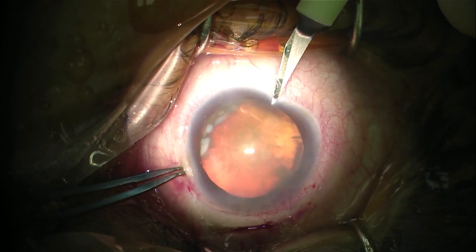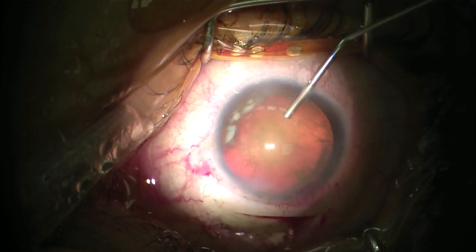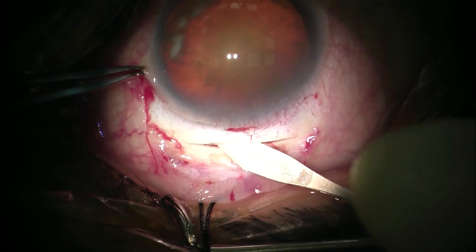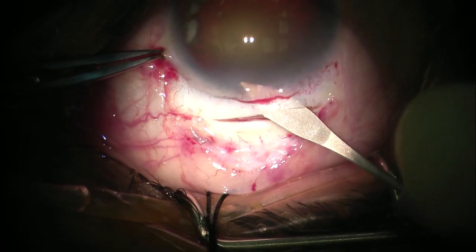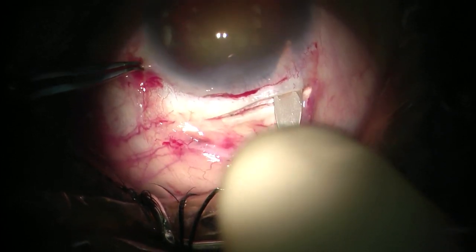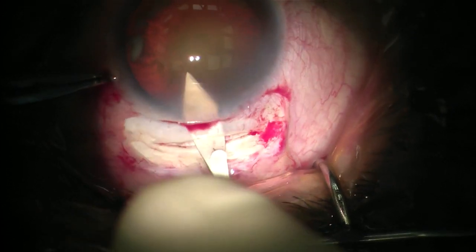Before entering the anterior chamber from the tunnel, we need to create a side port. You can place it wherever you want; I prefer it to be slightly inferior to facilitate removal of the sub-incisional cortex. The anterior chamber is filled with viscoelastic, then we open the tunnel into the anterior chamber. Do not enter the tunnel with the tip of the keratome as this will cause premature entry. Instead, enter with the side of the keratome, and once inside the tunnel, turn the keratome and open the tunnel into the anterior chamber. Make sure the tunnel is completely open from the inside, which can be confirmed by moving the cannula of the viscoelastic to the sides of the tunnel.